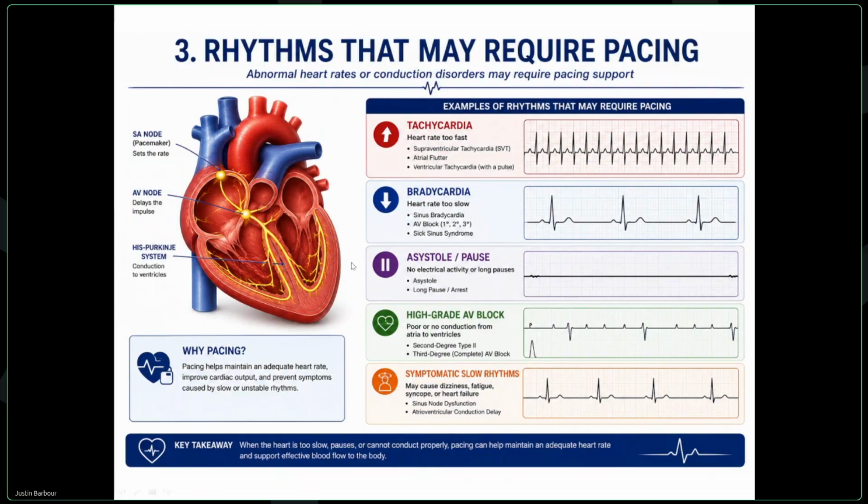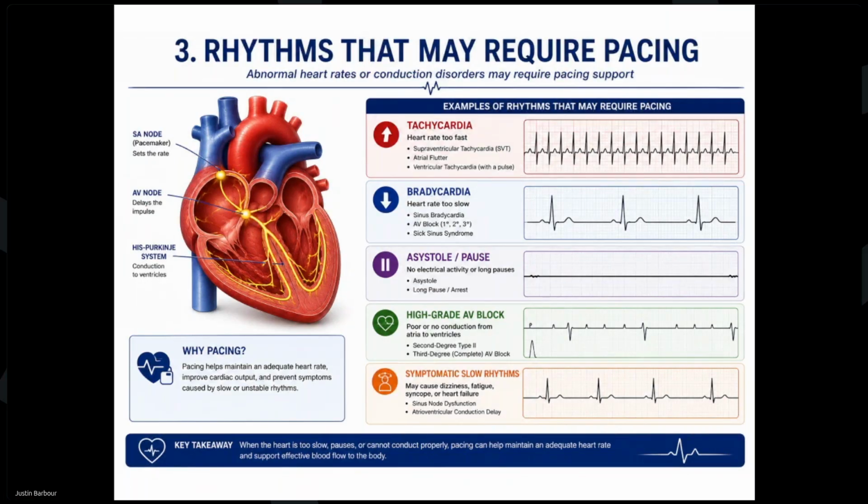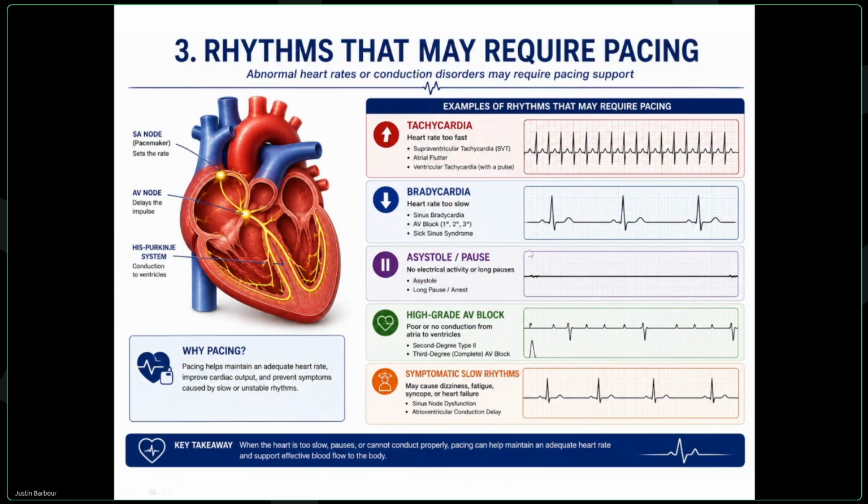The next condition is asystole. We've all seen it, we've all heard of it. Asystole is when there's not going to be any electrical cardiac rhythm, and it's normally called the flat line. And you cannot defibrillate a heart that is in asystole, because there's no electrical signal there for it to reset. It's a common misnomer, and a lot of TV shows and movies get that wrong. But here we have an asystole.